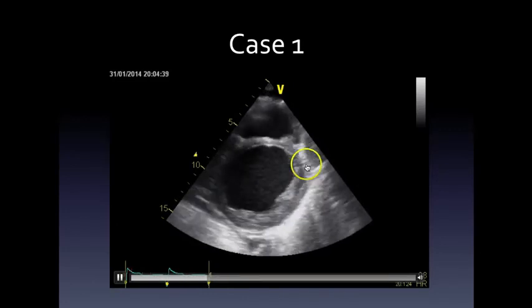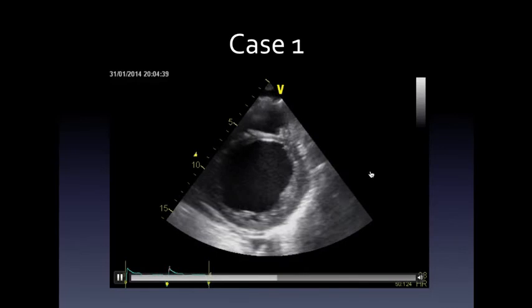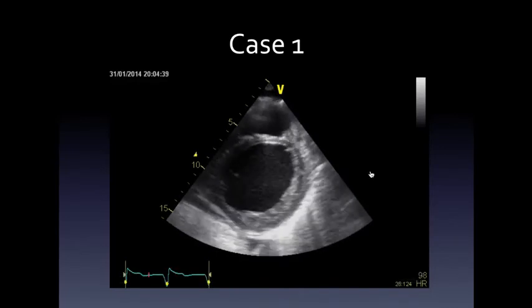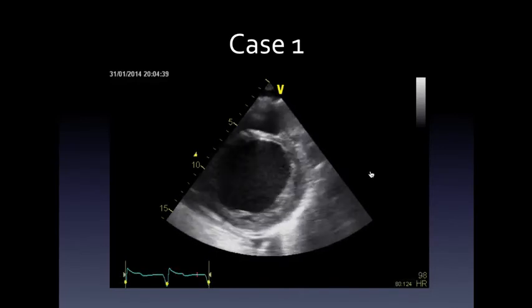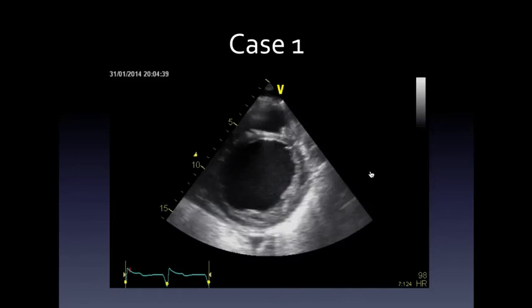Now that doesn't matter because there's just a little myth out there that if you have a bright pericardium, you have pericarditis, okay? This man doesn't have pericarditis. This is just that the gains were very high to increase the endocardial definition, which is highly appropriate. Just beware of the bright pericardium, okay? Anyway, that's a side point.